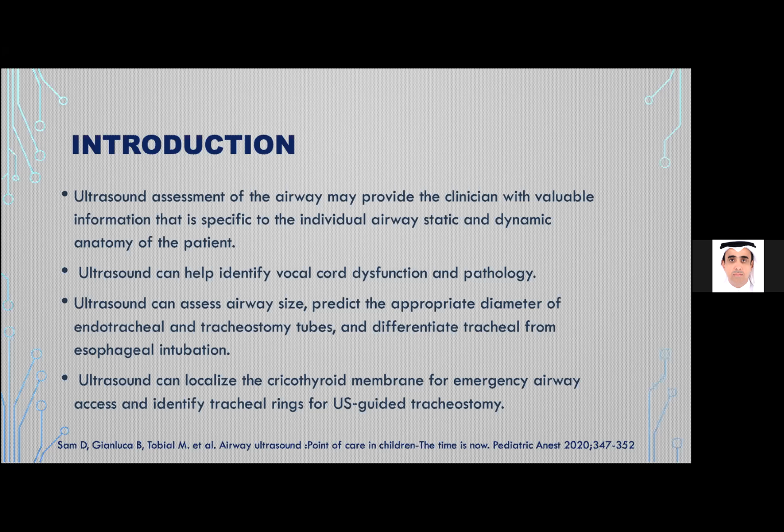Ultrasound can assess the airway size and predict the appropriate diameter of the endotracheal and tracheostomy tube, and can differentiate tracheal from esophageal intubation. Also, ultrasound can localize the cricothyroid membrane in an emergency situation, as mentioned by Dr. Maher. It is very crucial to localize the cricothyroid membrane in a difficult airway or when you are stuck and you have to help this patient. So it's very easy to localize by ultrasound.